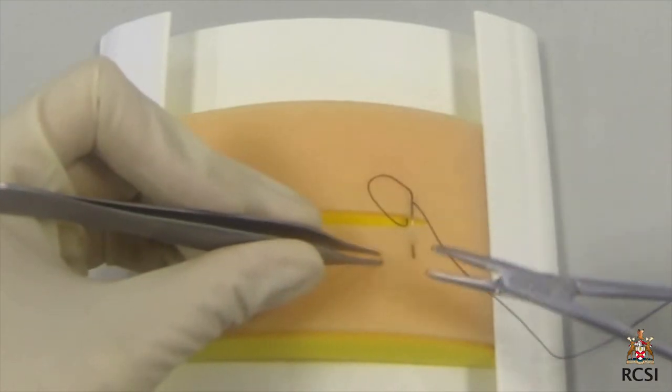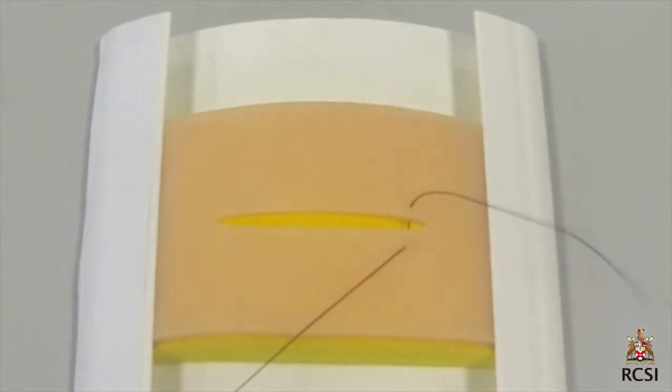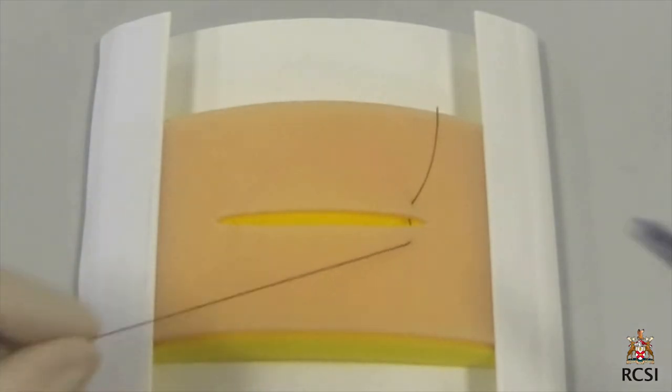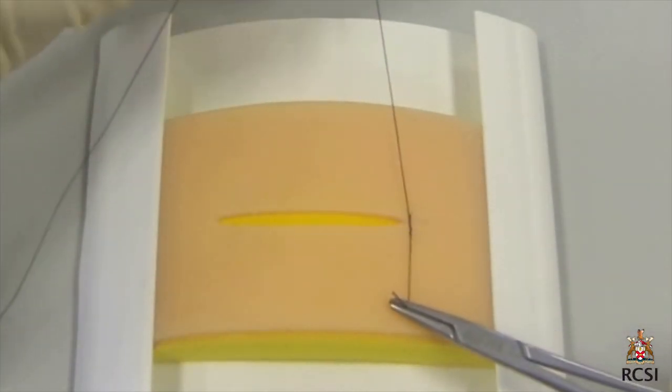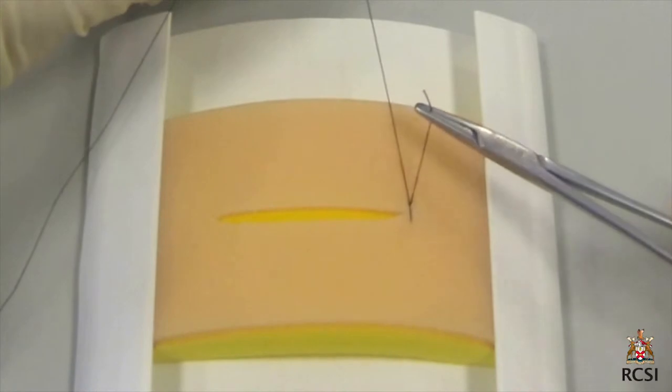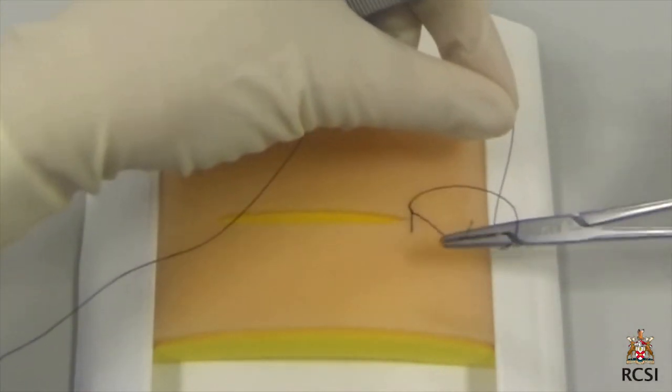When rotating the needle through the skin on the other side, eversion of the edge is aided by pushing gently with the forceps on the skin just in front of the exiting needle. The needle is removed and the suture pulled through. We will now perform a surgeon's knot by wrapping the suture around the needle holder twice and pulling the tail of the suture towards the surgeon.